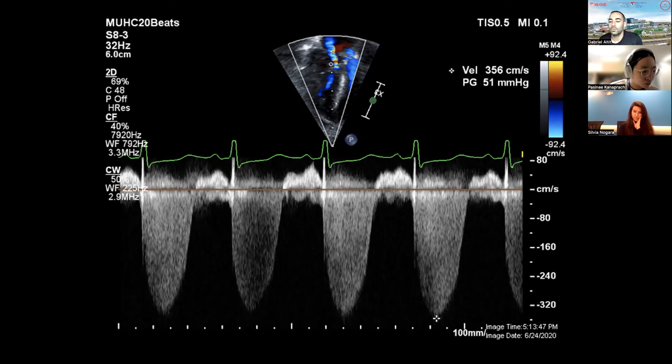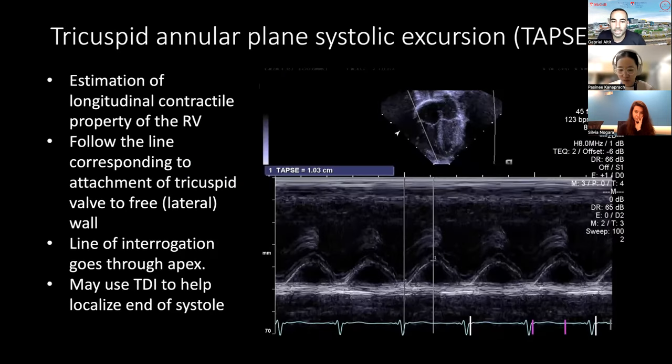It's often a marker that's used in congenital heart defects, like hypoplastic left heart syndrome. They're going to measure the systolic to diastolic time ratio as a marker of the systemic RV function. It's also been used in some of the patients with BPD pulmonary hypertension as a marker to follow the systolic function of the RV. We call this the systolic to diastolic time ratio, and I'm going to show you how to measure it in one of the upcoming slides.